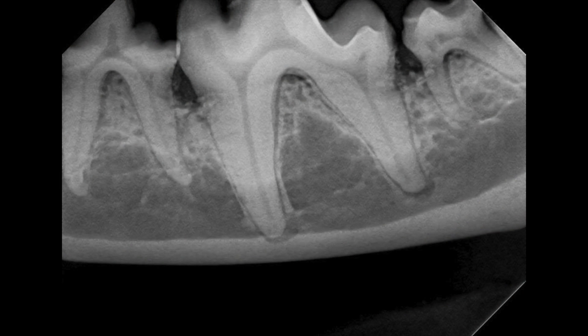From this point what we do is we place our bone graft. You can see our bone graft material there, which in this case is Synergy from Veterinary Transplant Services.